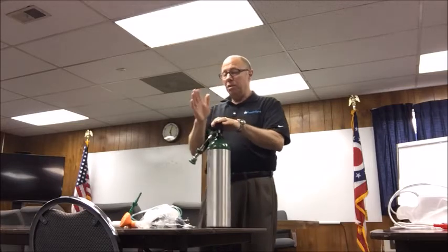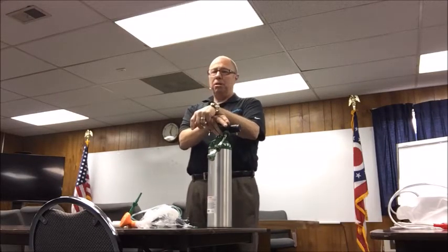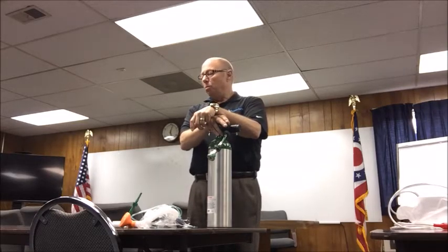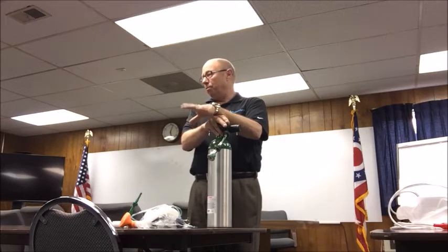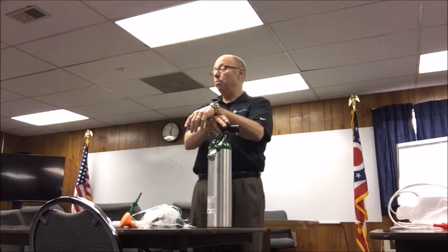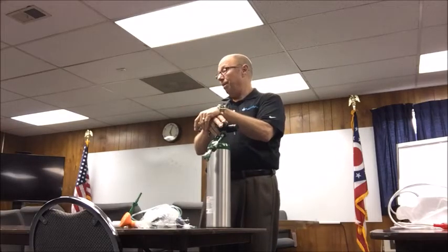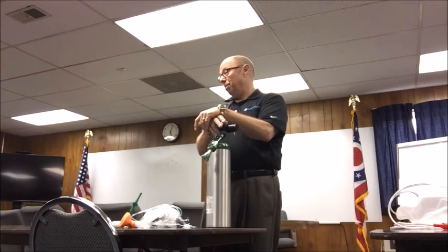The key to CPAP, and I'll say this many times during this, is CPAP needs to be started at bedside. The reason why is these people have been in distress for a long time. Some of you have frequent flyers, and we all have them. They're sitting there thinking, oh my God, I can feel my lungs filling up. I'm having trouble breathing. I don't want to go to the hospital. I don't want to call EMS because I know what they're going to do to me. I know what happened last time. They can be 35, 40, 60 minutes into the episode before they call us.